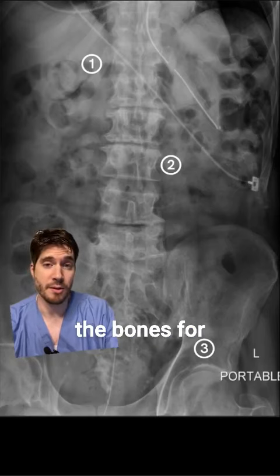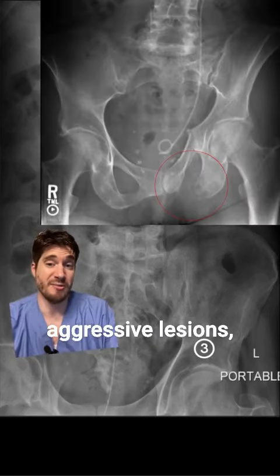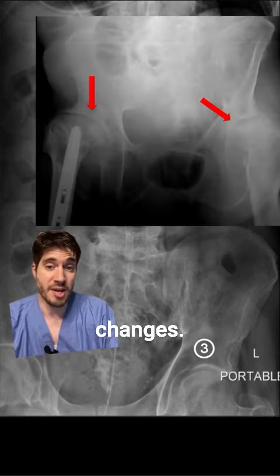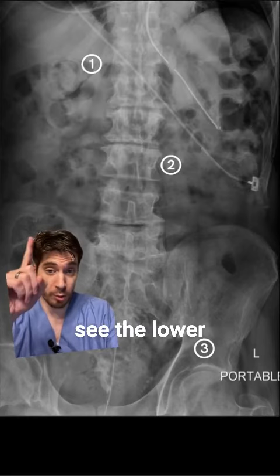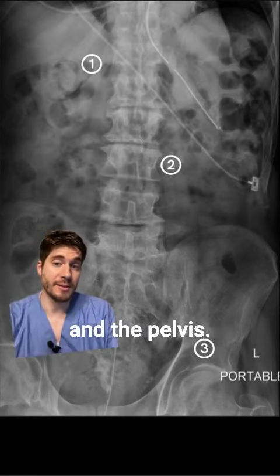Finally, look at the bones for fractures, aggressive lesions, or degenerative changes. Normally, we can see the lower ribs, the spine, and the pelvis.